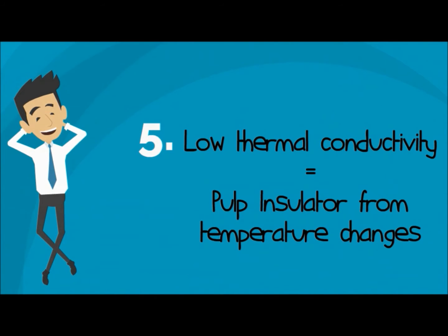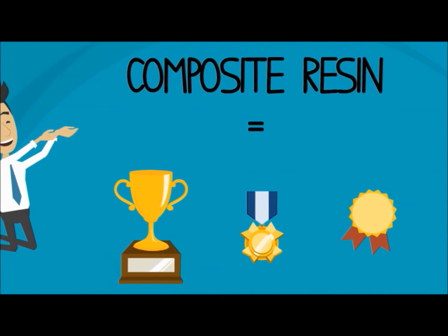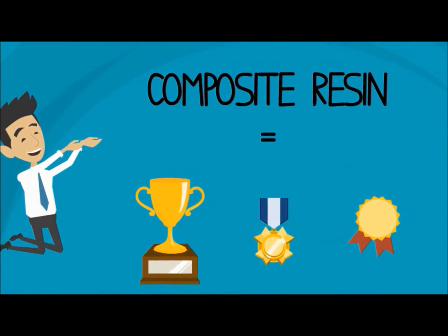Lastly, composite has low thermal conductivity, which means it is capable of insulating the pulp from temperature changes and further pulp damage. Now, can we conclude that composite is the winner of tooth preparation? Yes, we can!